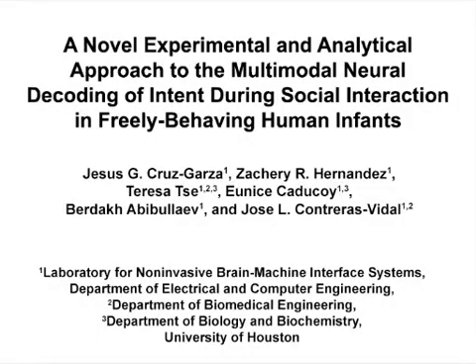The overall goal of this procedure is to capture brain activity and kinematic data from infants by integrating synchronized high-density active scalp electroencephalography, inertial measurement units, and video recordings.